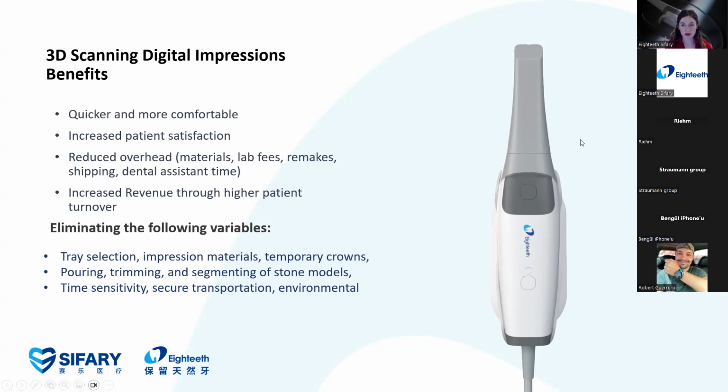So actually the patient starts when they visit the doctor, they start to ask, do you have an intraoral scanner? What kind of way are you taking impressions, yeah? And eliminating many impression materials, temporary crowns, and basically time and materials.